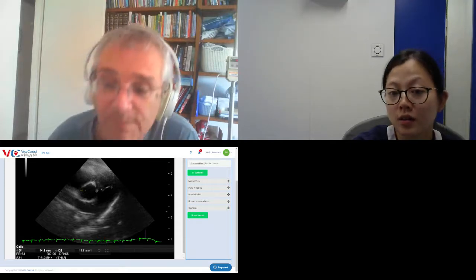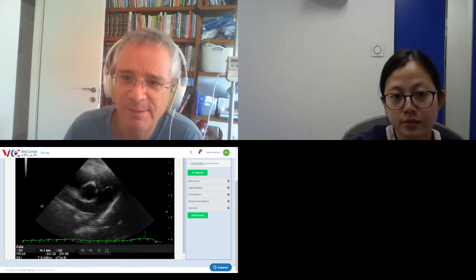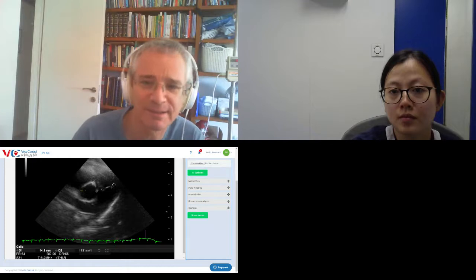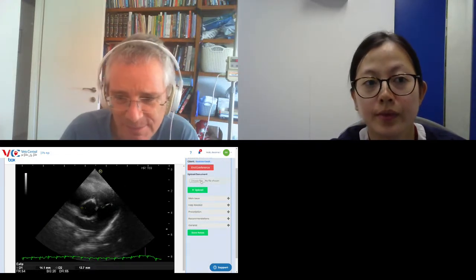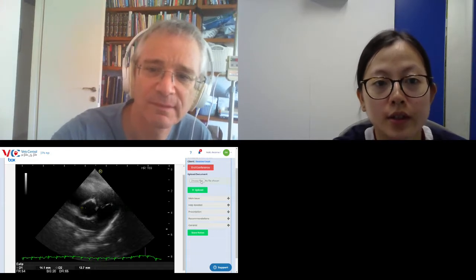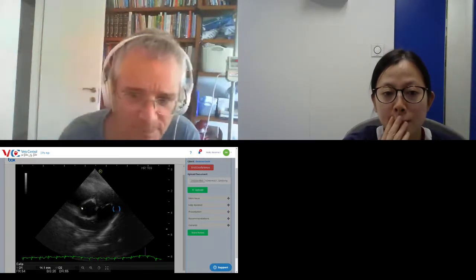If it is, then this might be a diastolic frame, which makes sense because the pulmonary valve is closed. But the aortic valve should be closed at the same time, and it doesn't seem to be. So maybe the plane is not ideal, but I think this image supports your suspicion. It is supportive. I think the pulmonary artery is too wide, as in pulmonary hypertension.